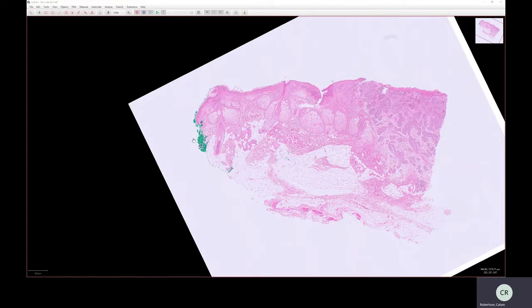So pathology has been around for around a century or slightly under. For the vast majority of that time, this has involved looking down a microscope. Over the last few years, we've started a slow transition into digital pathology, where I think eventually all diagnostic slides will be scanned, and we'll be viewing them in this way. But for now, we still use microscopes. And this is exactly what you'd see down a microscope, except it's the scanned version.